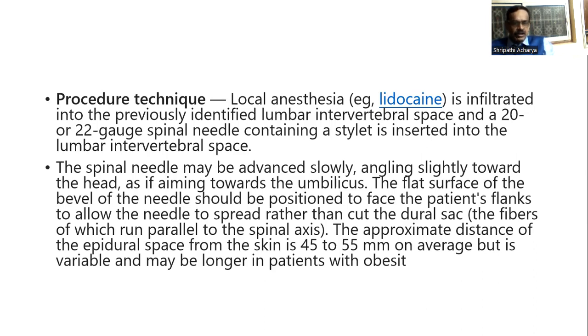The spinal needle may be advanced slowly, angling slightly toward the head as if aiming towards the umbilicus. The flat surface of the bevel of the needle should be positioned to face the patient's flanks to allow the needle to spread rather than cut the dural sac, the fibers of which run parallel to the spinal axis.